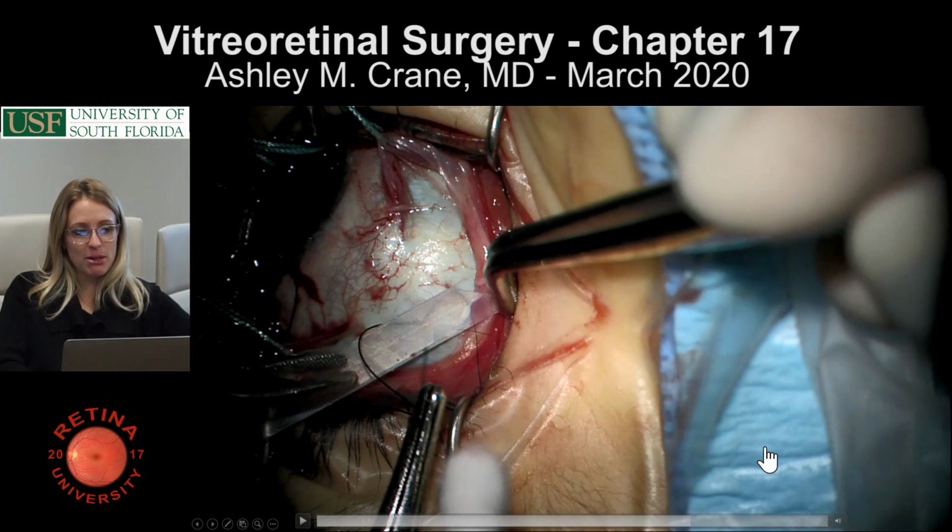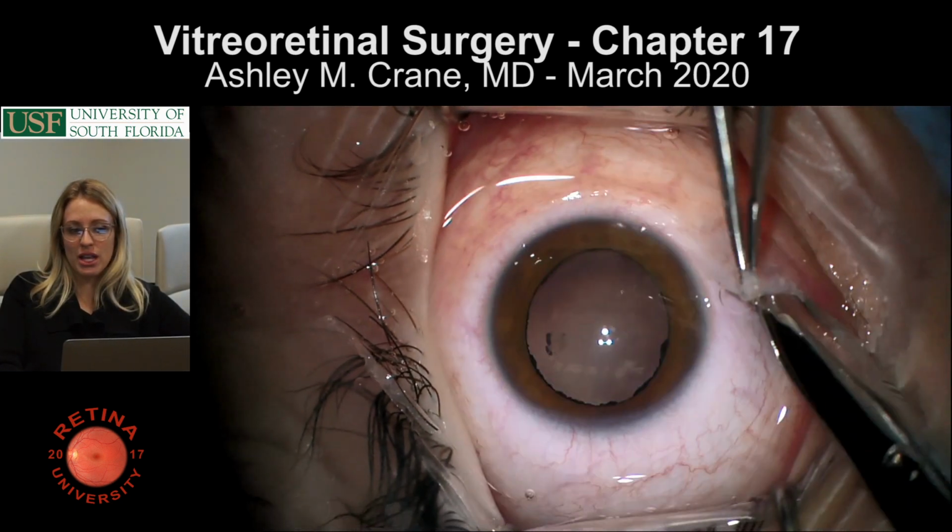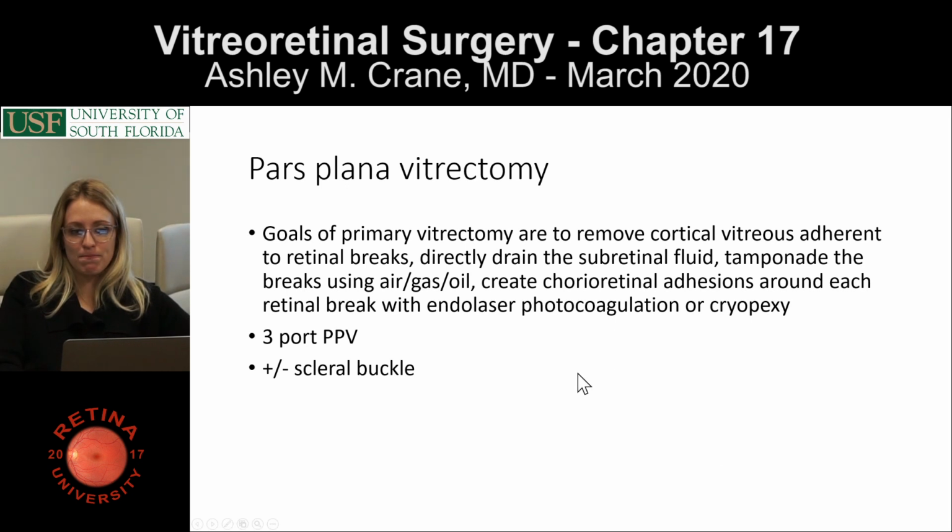So pars plana vitrectomy, the goals are to remove the cortical vitreous and to drain the fluid. Basically, you also want to give a tamponade to push the retina back in place and to close the break, and create a chorioretinal adhesion with a laser or a cryo. And this is usually a 3-port vitrectomy. You can use it with a scleral buckle.